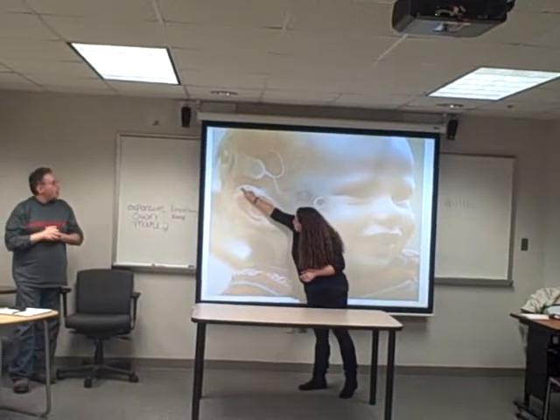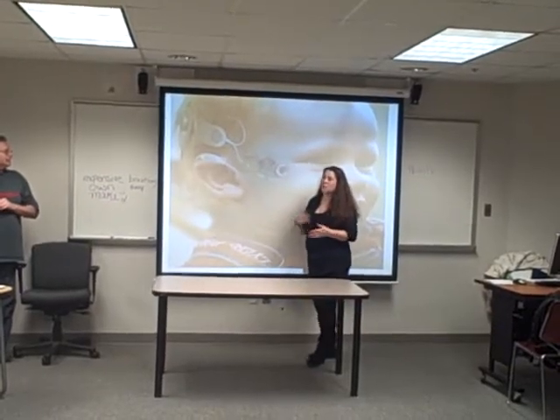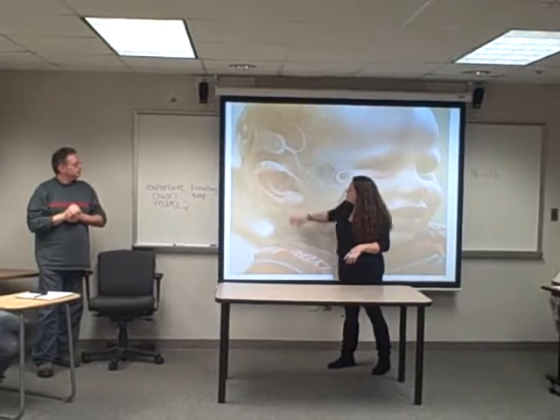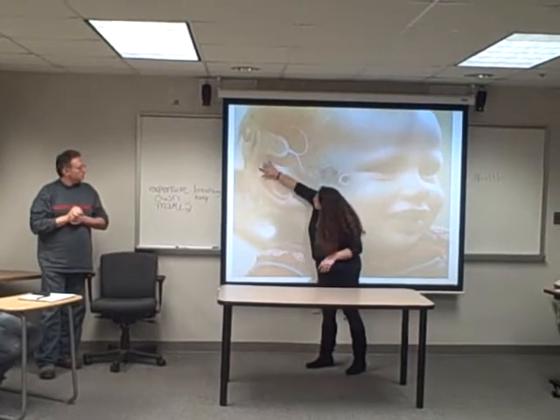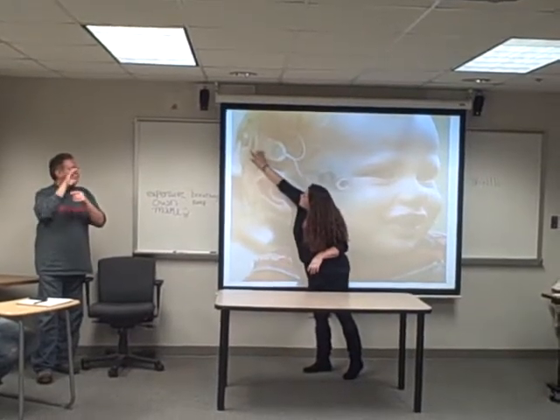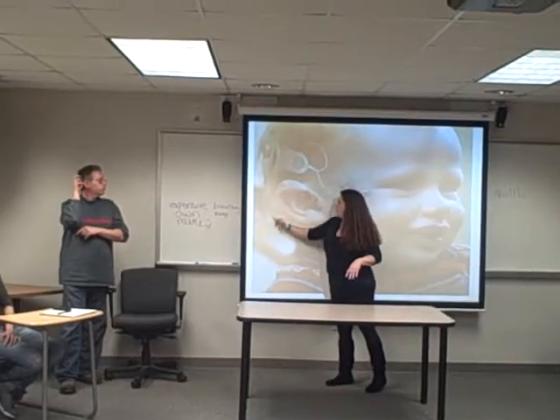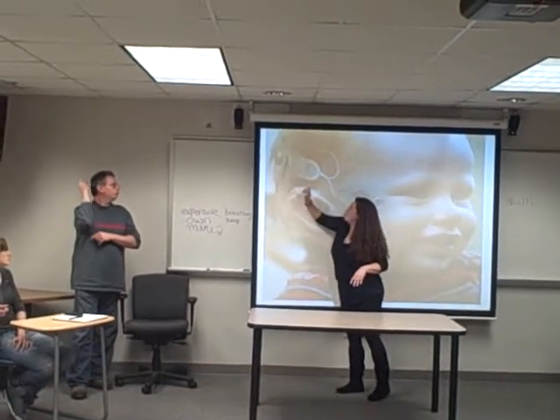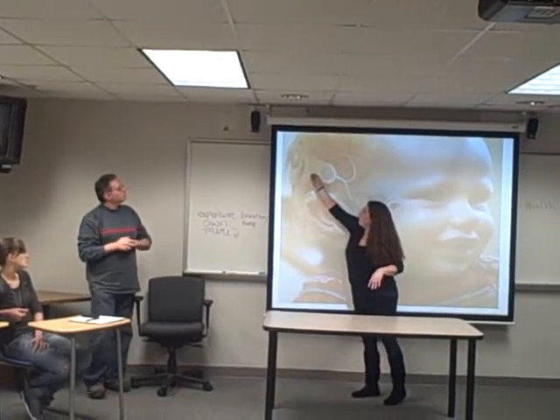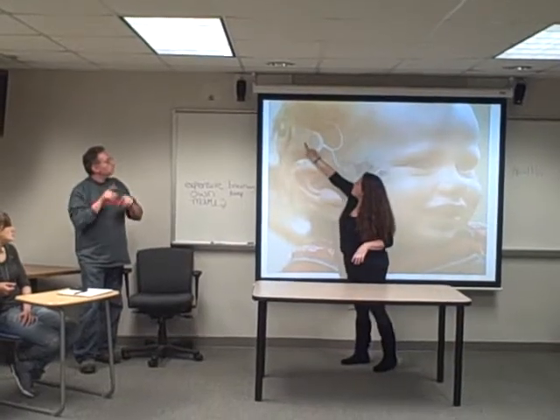So the external piece is the microphone, which is also attached to the sound processor, which controls the volume, the frequency, and the program of the implant. And then up here is attached a magnet. There's a coil that runs here. This is a magnet receiver that receives the sounds that come in through the microphone and travel up the coil to the internal magnet, to the external magnet. The internal magnet keeps the external magnet on the head, and that is also a receiver that picks up the sound.